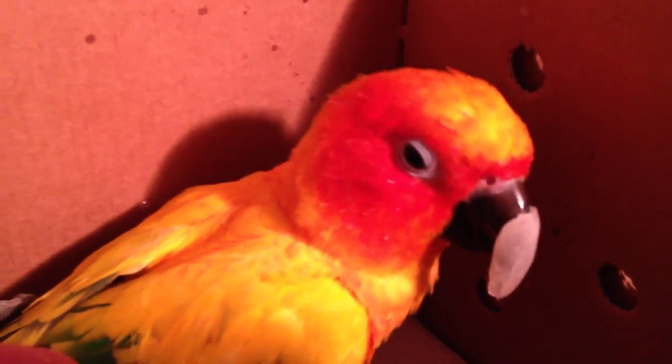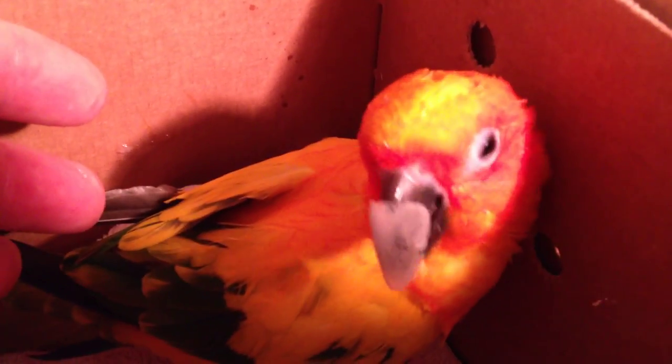That is glued on and then pinned on. And what it does — you can actually see the left side is longer than the right. It's like that so we can actually have his lower beak make its way to where it's supposed to. Right now he's just arguing with it — he doesn't like it, he's trying to shake it off.